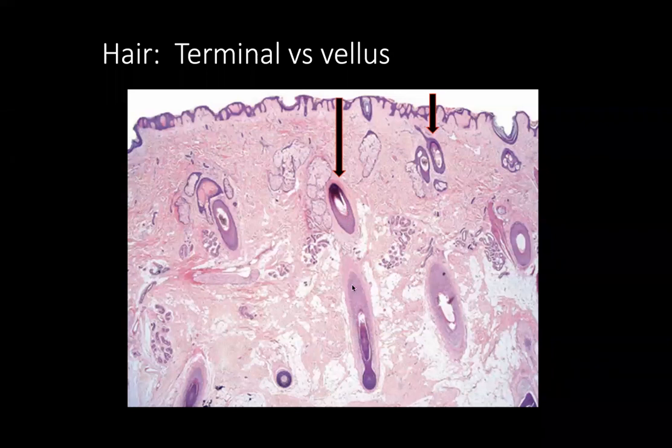That's usually only a process of 3 weeks or so for the anagen hair follicle to transition to a telogen hair follicle. While the anagen hair follicles can be present for 2 to 6 years, the telogen hair follicle can be present for about 3 months, and then it often will release the hair shaft and enter back into the anagen hair follicle stage.